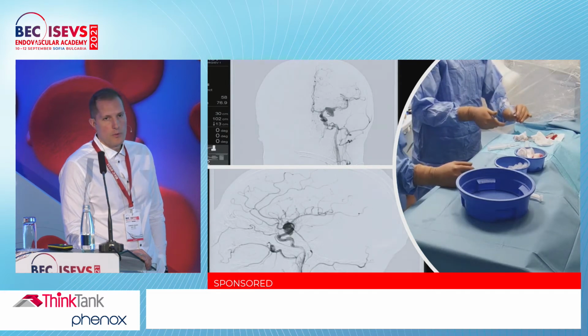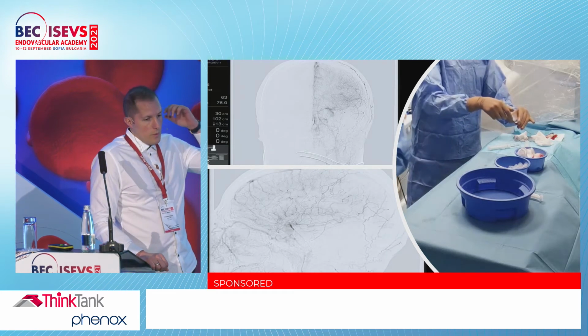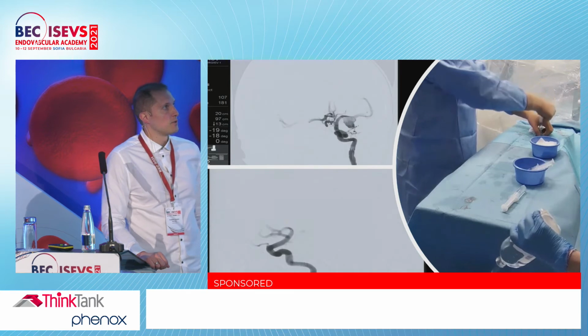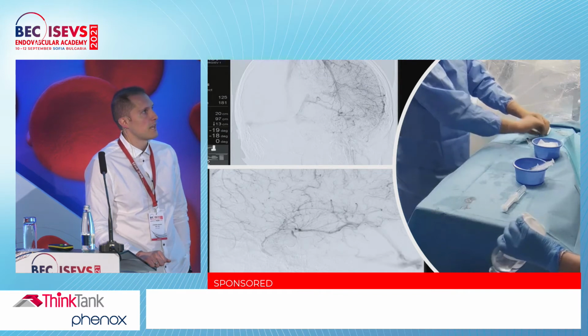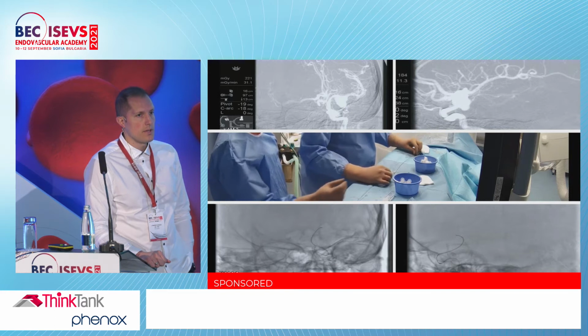So there is no option for a classical surgery here. We spoke with the boy and the relatives, and we decided to go for the endovascular treatment, in which our strategy was to put a flow diverter stent from the healthy portion of the M2 segment and not to cover the A1 origin. So we have to finish just before the origin of the A1 segment.